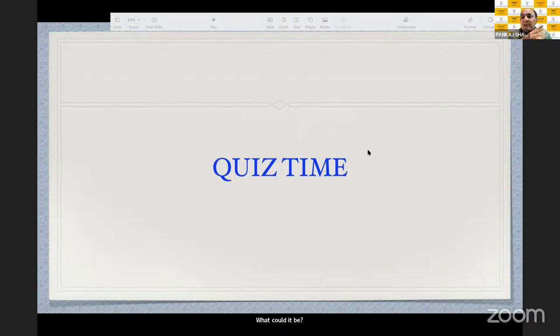Usually a thin cornea will be ectatic and high power, but a thin cornea with flattening means there is a facet or a previous corneal infection which has led to fibrosis and flattening. So you can have a nebular corneal opacity. If you look carefully, the cornea will be thin and flat. One of the residents has answered that it could also be post-LASIK, a thin cornea, obviously because the anterior ablation is there now.